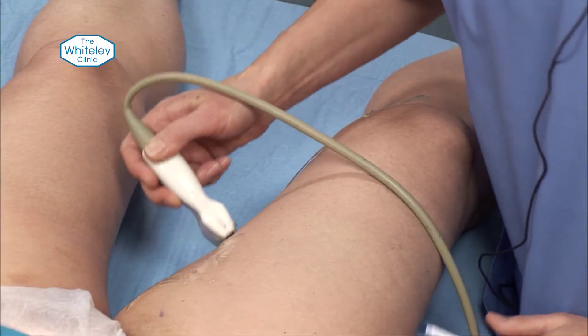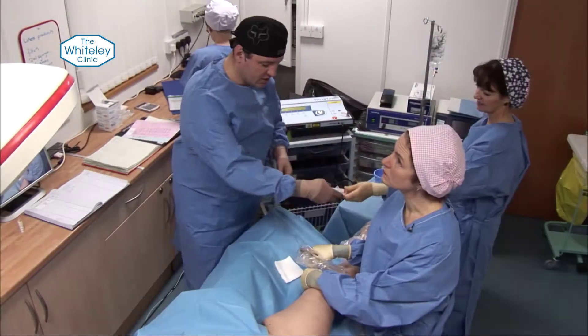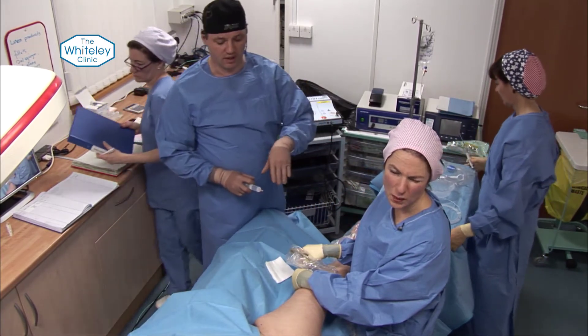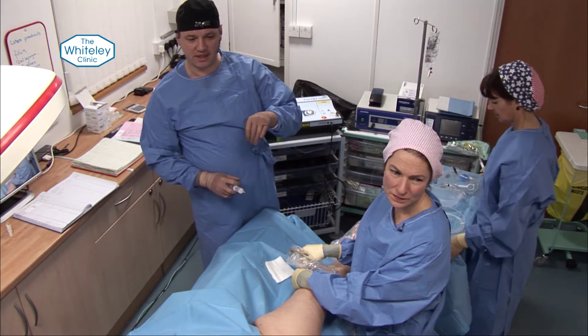Marking the vein at intervals where the local anaesthetic will go in and also to give us quick access to the line of the vein. The procedure starts with a little bit of local anaesthetic coming in line longitudinally with the ultrasound probe so we can see exactly how we're going to get in.